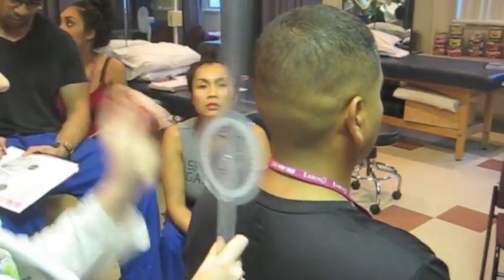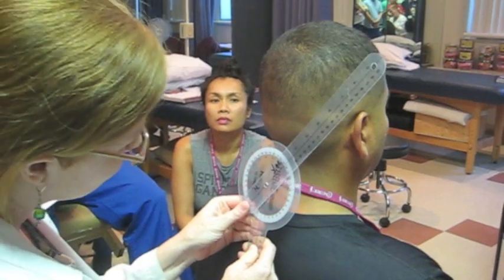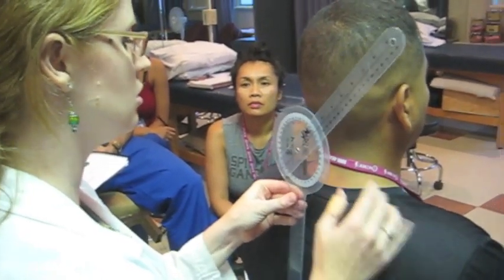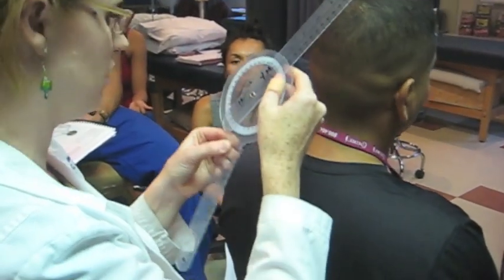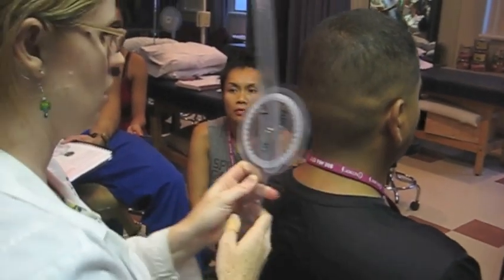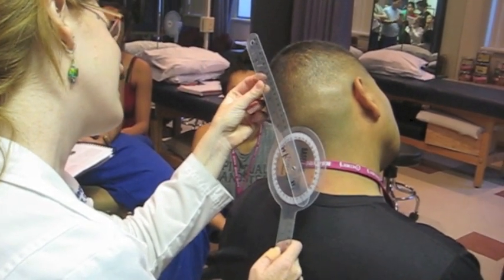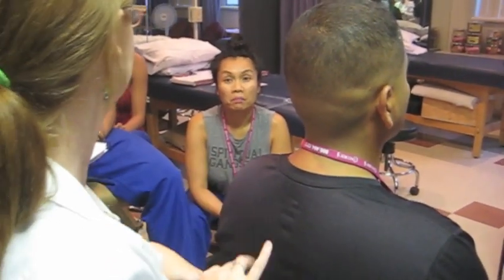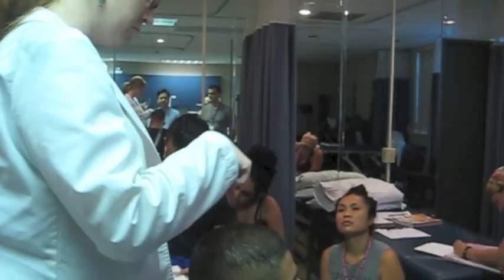So C7 vertical. Tilt to the right. And come back. We've got 28. And tilt to the left. Keep your nose straight ahead. Good. And come back. And 34. We've got more to the left — we're loosening them up. So that was what we call lateral flexion. Now for the next measurement, the starting point is just the middle of the top of the head.